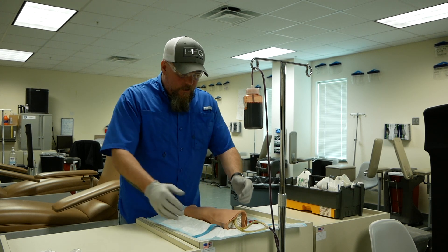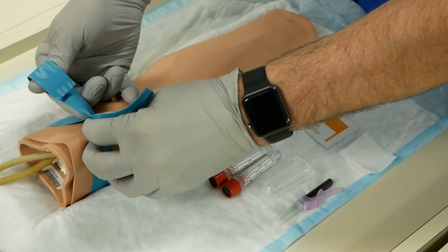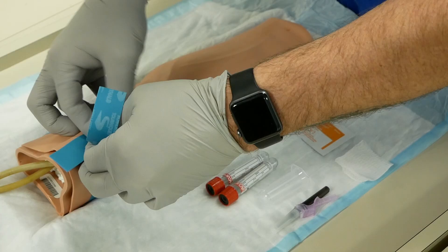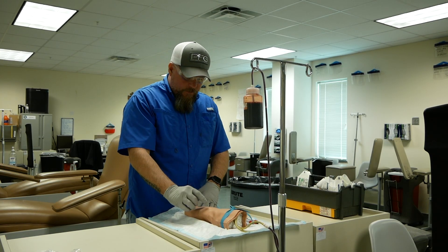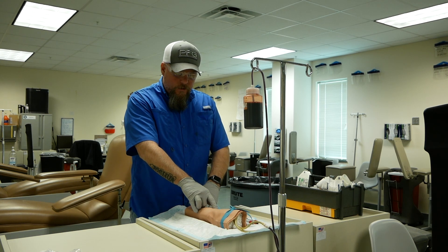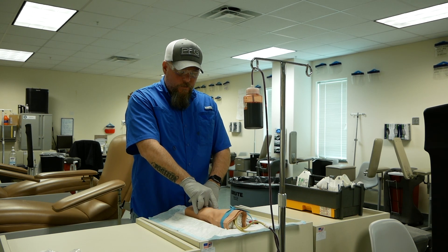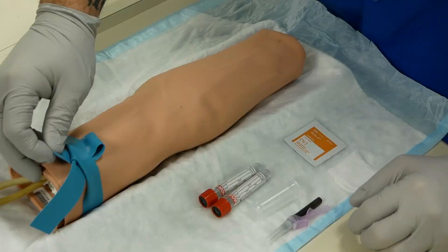We're going to apply our tourniquet two to four inches above the site and instruct our patient to make a fist. We're going to go ahead and palpate for our vein, ensuring that it's not rigid, cord-like, or rolling — it should actually rebound when you push on it and let go. Once you locate your vein, you're going to go ahead and release your tourniquet.